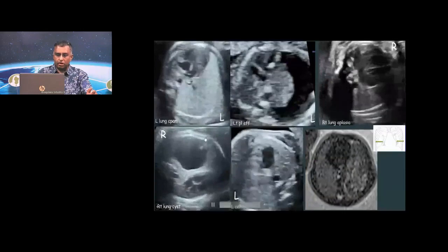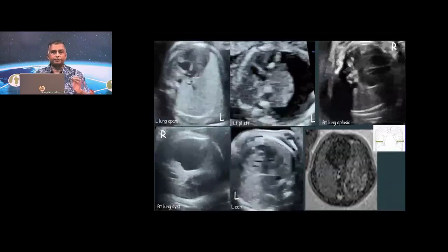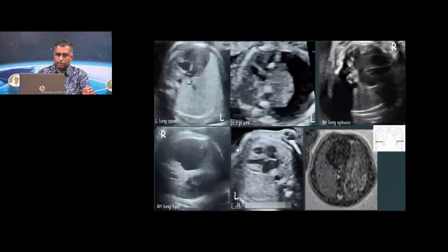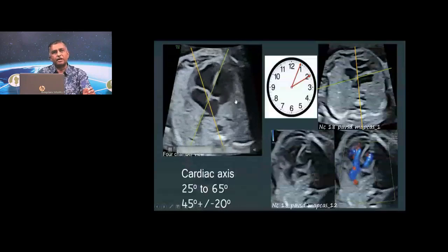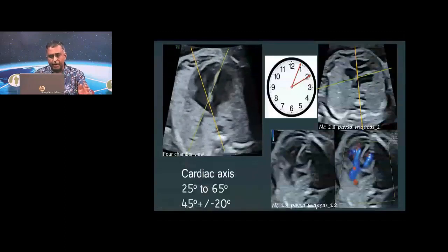Let's stop these clips. These are all very evident, but in less evident cases, you need to be very, very critical in your observation. Critical in the sense that if you draw a midline median from the spine to the sternum, in the normal situation, that's the line I'm talking about. This is the line. Sorry, this is the sternum. If you look at the heart in relation to this line, you'll find 2/3 of the heart to the left and only 1/3 of the heart to the right of the line. And that is one thing we should bear in mind.